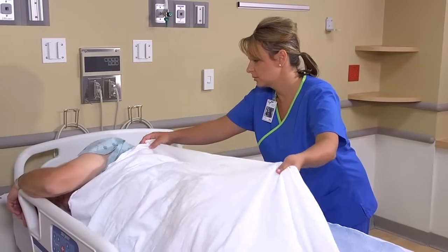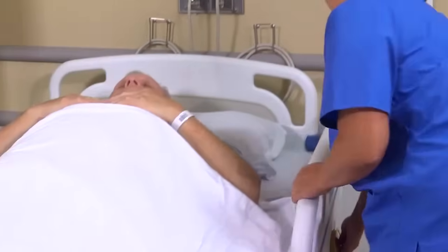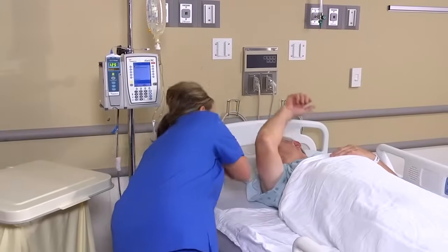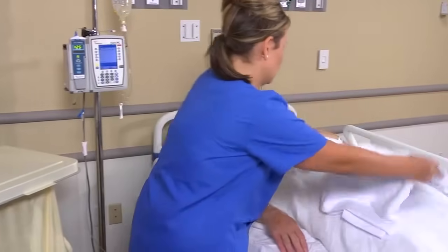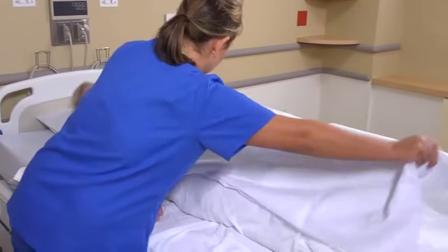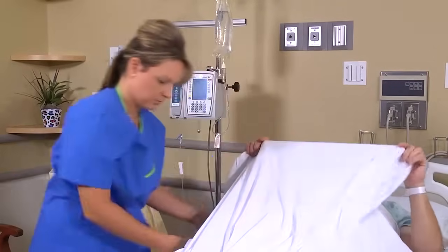Okay, Mr. Hayes, I'll have you roll back over to your back. Cover him with a top sheet, placing the vertical centerfold lengthwise down the middle of the bed. Open the sheet out from head to foot as you unfold it over the patient. Be sure the top edge of the sheet is even with the top edge of the mattress.